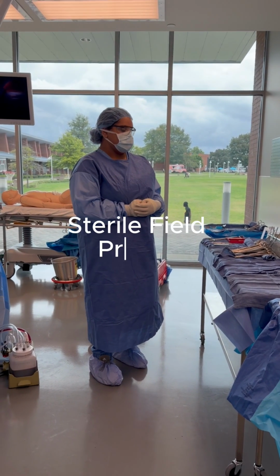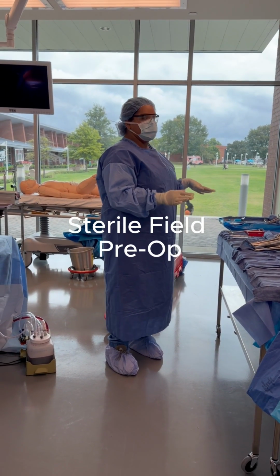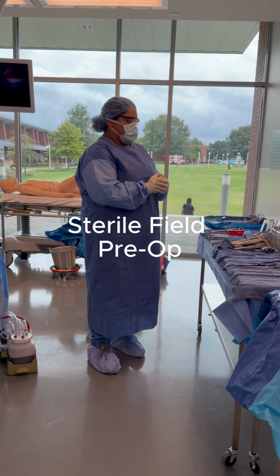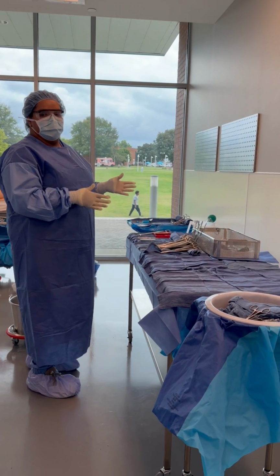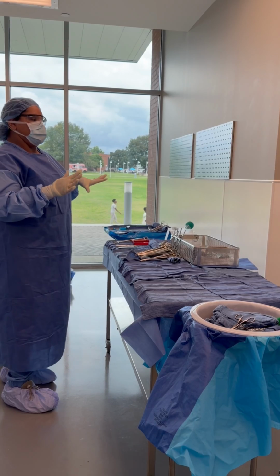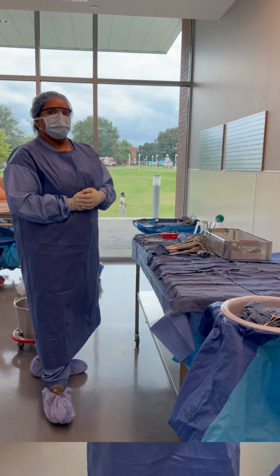I'm the surgical technologist, and we have our back table, our basin, and Mayo stand. This is where I set up everything before the surgery, making sure it's away from all other traffic, and I'm facing it. I don't have my back towards it. I'm making sure no one goes in this area, and it's away from the wall and all the other traffic in the way.